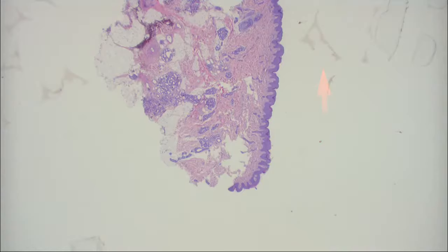Excellent. Very good. If you live in Texas and you've been around for more than a few years, you're probably going to have some solar elastosis, unless you're biopsying something in the groin or somewhere with no sun exposure at all. But there's a couple other clues. It's a pretty thin punch biopsy, and it goes way down to the bottom of the fat. So the whole skin is fairly thin. So it's a young patient. And notice these hair follicles are small and miniaturized. This isn't an alopecia. And the sweat glands are kind of small. So everything is small. It's a baby or a kiddo. So it's a youngster.